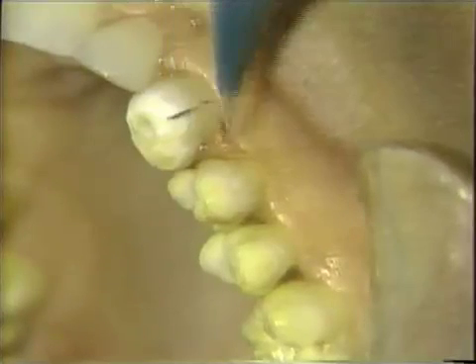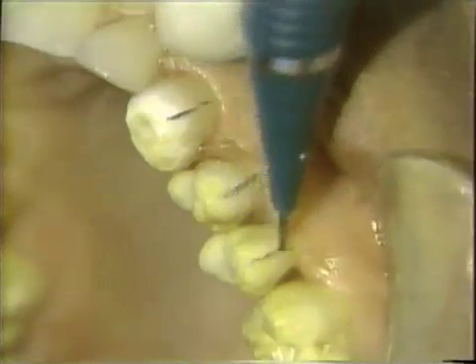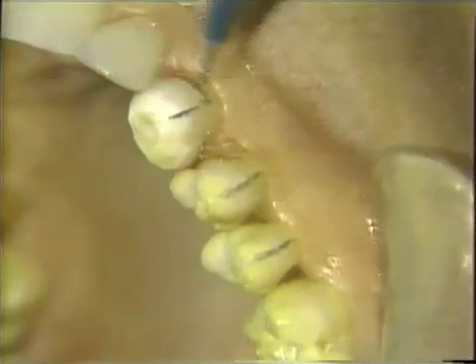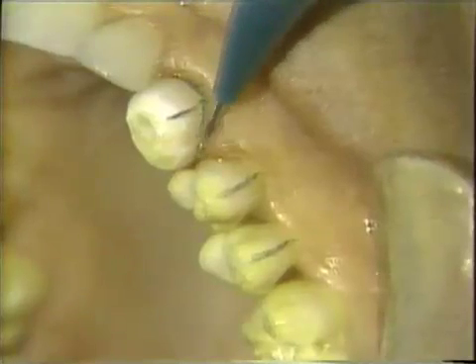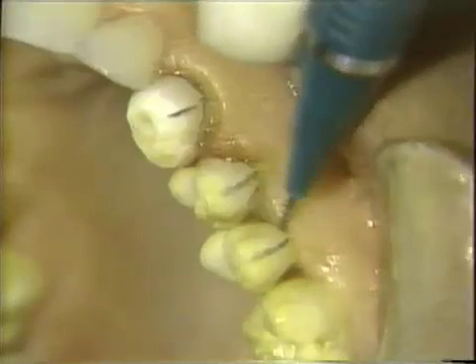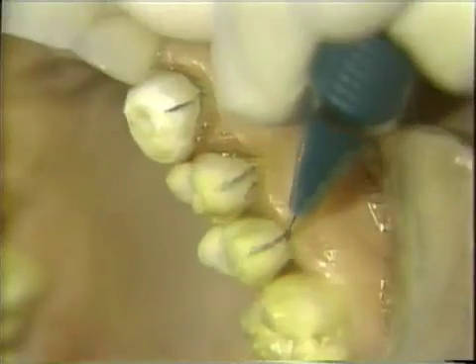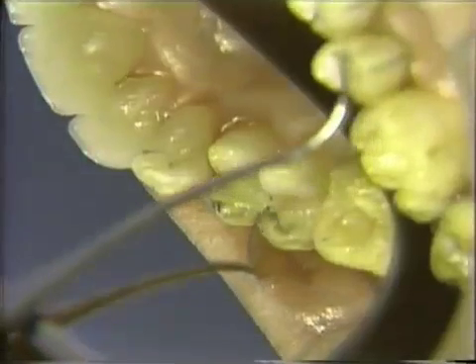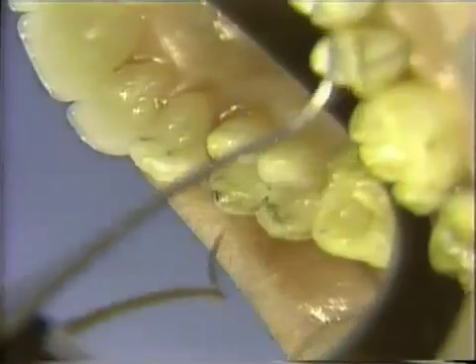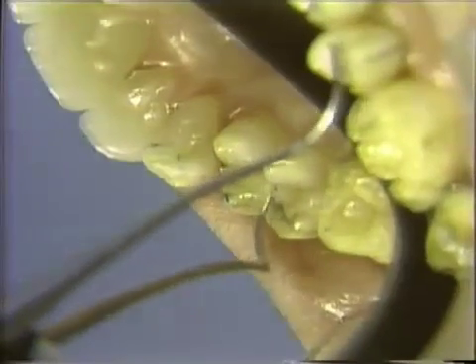We will start by making a mark and following this up with a tracer cut on that buccal surface. Then the cervical will be removed to this pencil line. We have outlined with pencil where the finishing line will be on the occlusal surface, making sure that we have enough room for the lower cusps.